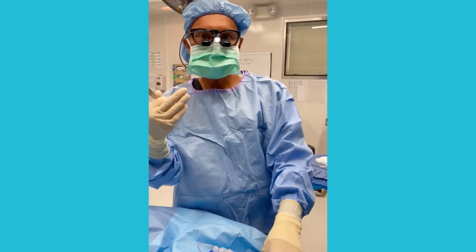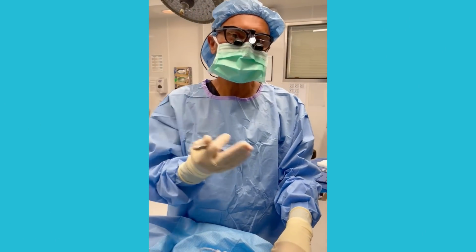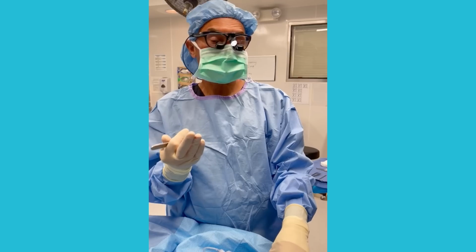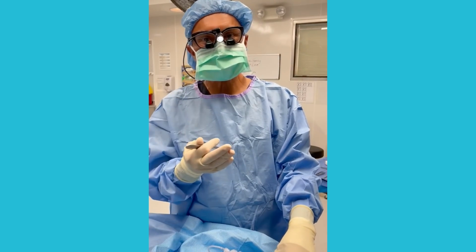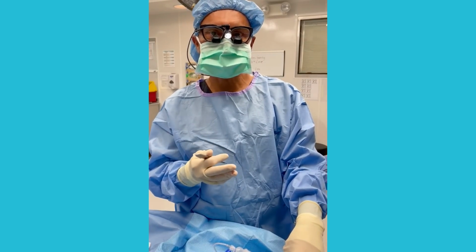So for this, we have to make a vertical incision, not horizontal, because with horizontal you can sever the nerve. It's more likely to happen, so definitely vertical incision and very, very careful dissection to avoid that, and the labial artery. So we'll show you in a second.